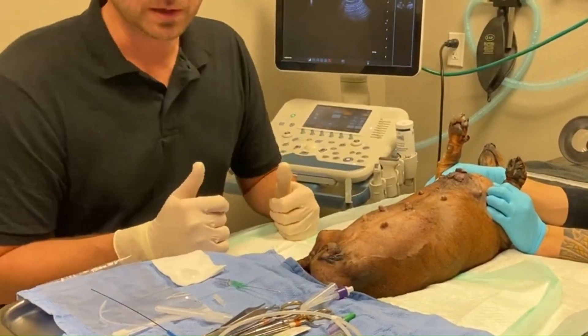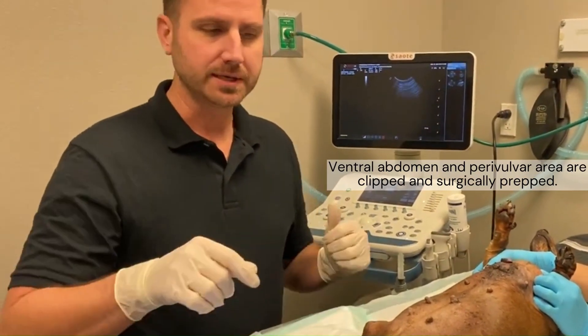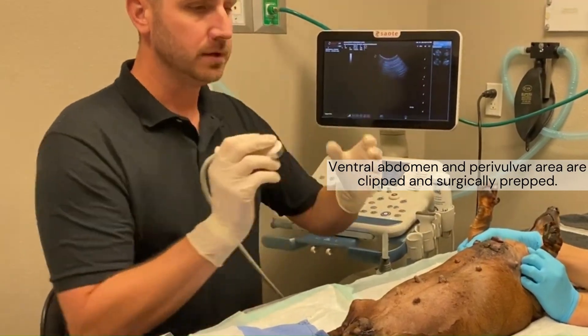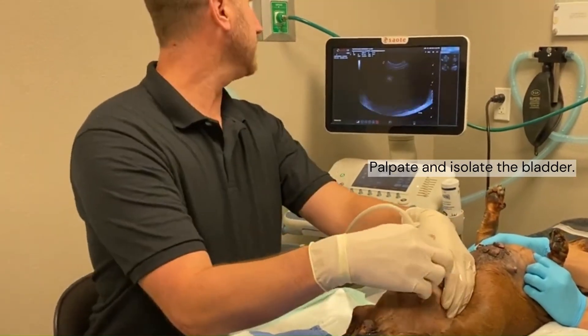What we have here is a paralyzed dachshund that is not able to urinate, so what we're going to do is place a catheter and keep her overnight so that we can get this bladder emptied. You can actually see it here. I'm going to show you real quick on the ultrasound.